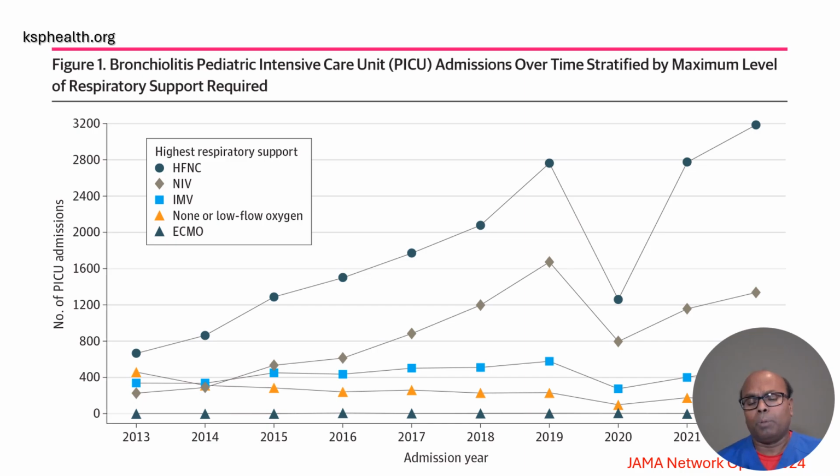This is the information published in JAMA a few months ago. They identified the usage of high flow nasal cannula, non-invasive ventilation, and invasive ventilation from 2013 all the way to 2022. As you can see, the usage of high flow nasal cannula has gone up significantly, except during 2020 because of the COVID pandemic.